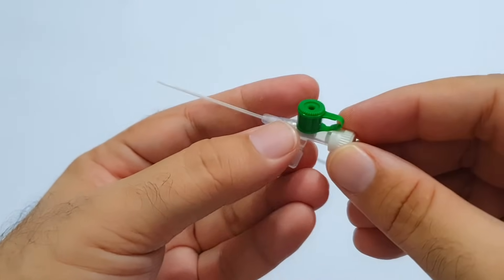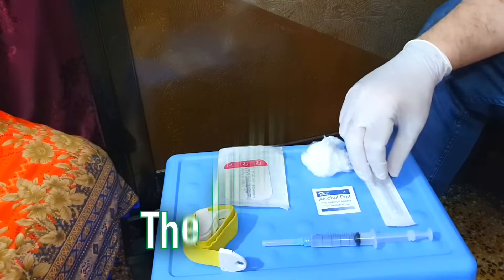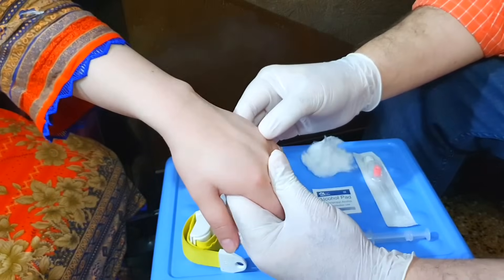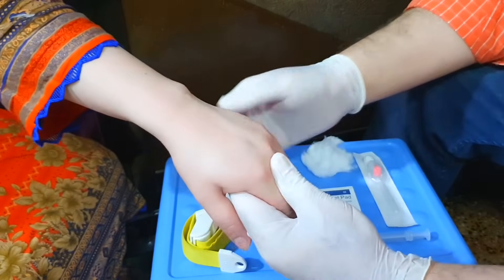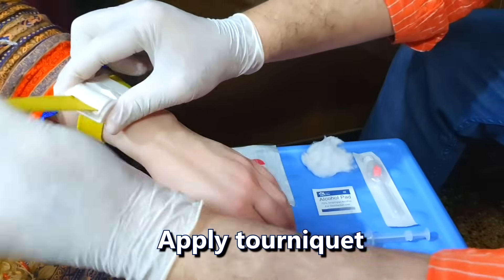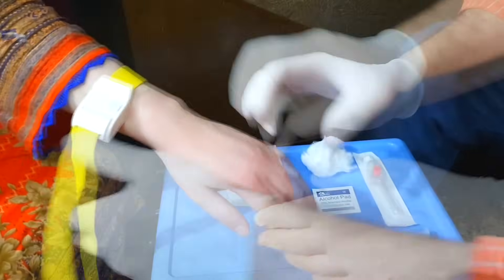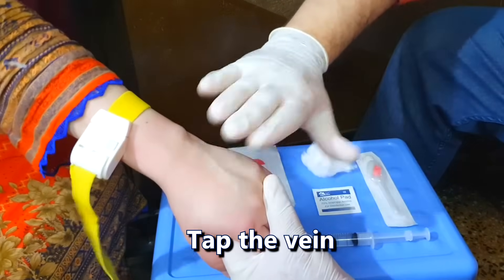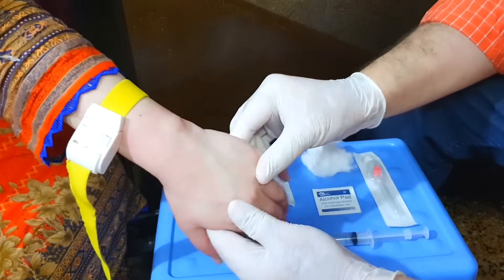Make sure you have all the items available that will be required for IV cannulation. Wear gloves to avoid getting in direct contact with the patient's blood. Apply a tourniquet above the area where you want to put the IV cannula. Ask the patient to open and close the fist a few times. Tap the desired vein a few times — this tapping will dilate the vein and make it prominent.